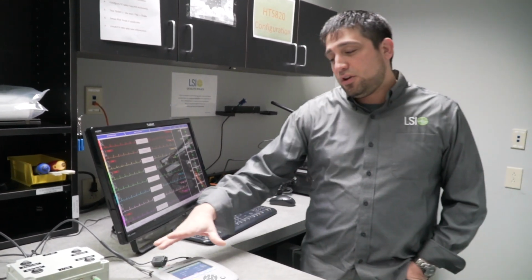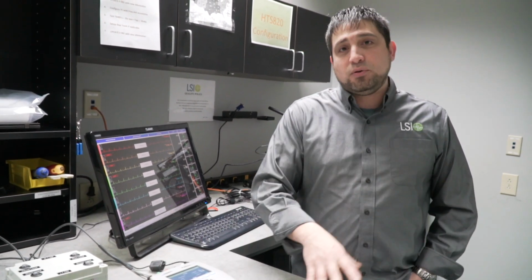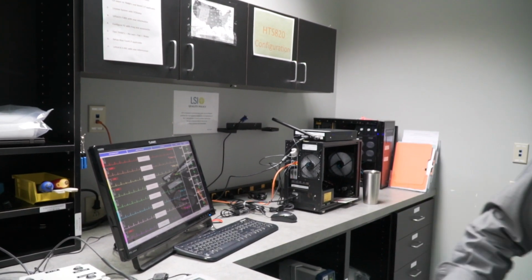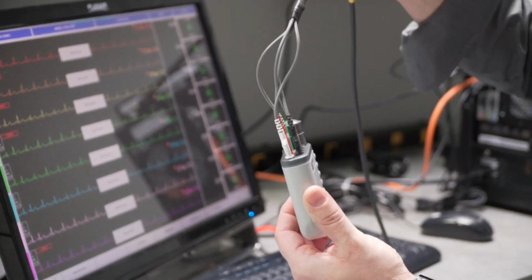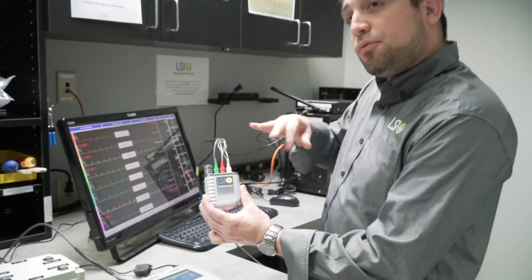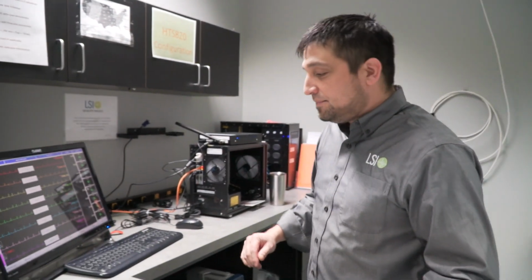The concept is we want to use one splitter to feed multiple transmitters. That way we don't have to have a simulator for each transmitter. So here are the transmitters, and you can see that they have 5 leads. You can test the human heart rate with 3 leads, 5 leads, 12 leads. Typically in our applications we test it with 3 or 5 leads.